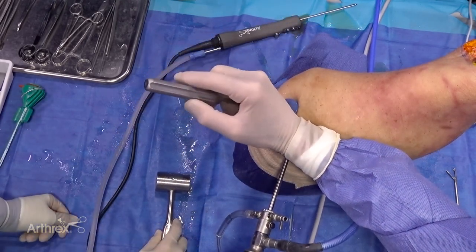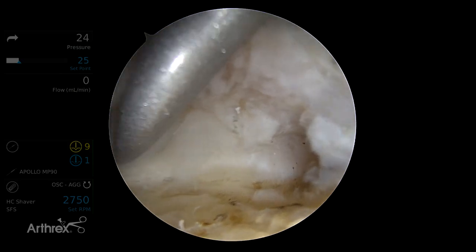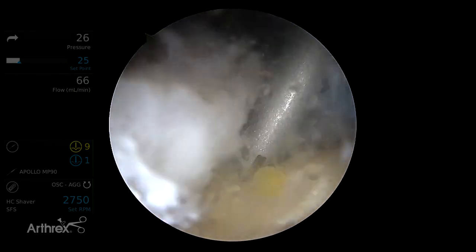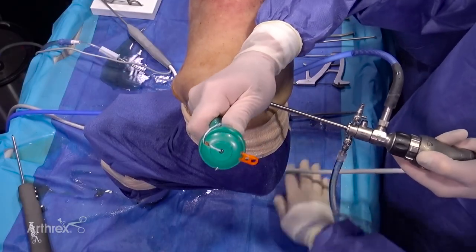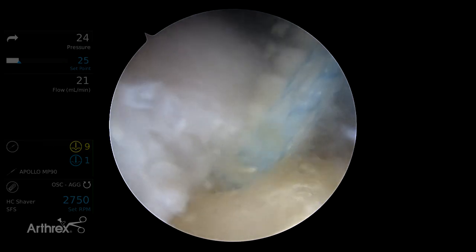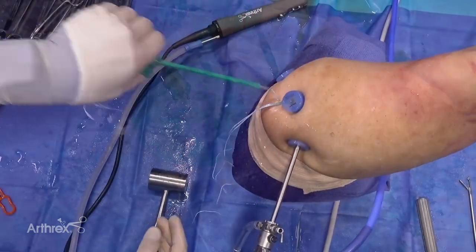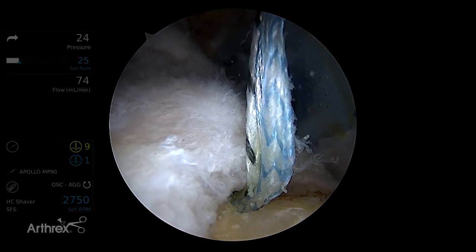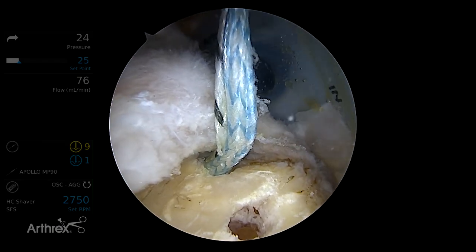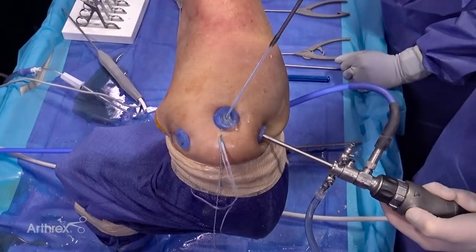We're going to create our medial row anchor placement. First we're coming in with our swivel lock punch — we're going to make our medial row anterior anchor placement first, just behind the biceps tendon to restore the area of the anterior cable. Now here's our knotless swivel lock device coming in; this is pre-loaded with our fiber tape. We bring the swivel lock anchor down to our hole and insert. We'll grab our medial tape, anterior medial tape, and bring them both out together.